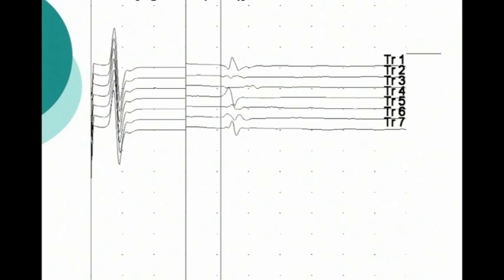Look at this. You would say that this is probably a very good F wave, and I agree with you. But what is wrong with it? Well, let's see what's right with it. The M response is great. We can easily identify the F responses, and we can easily identify which ones are the shortest latency. What's wrong with this?